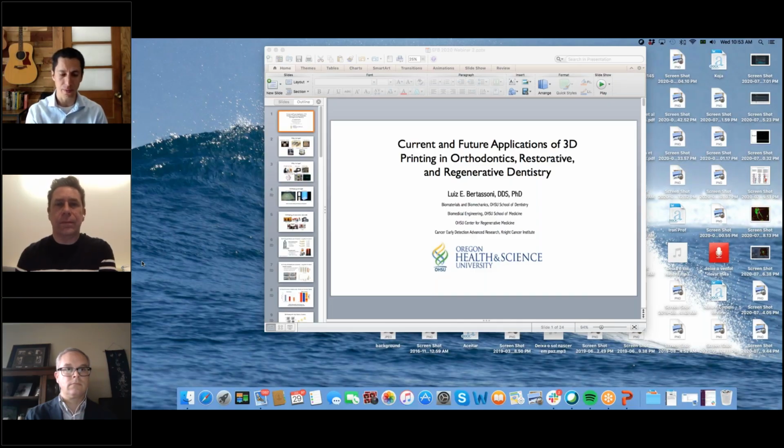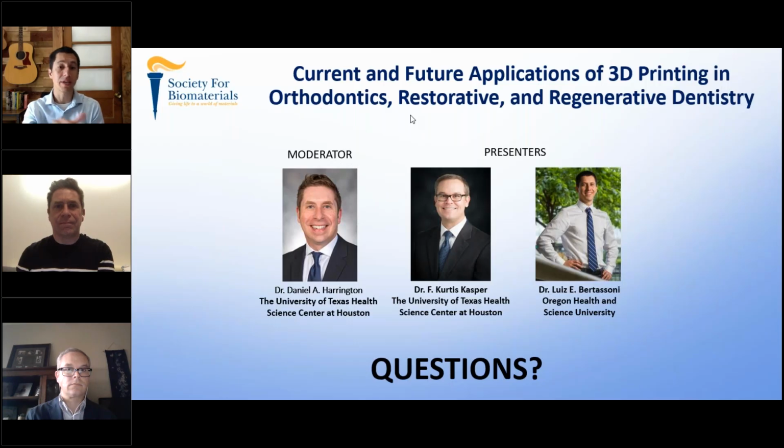I don't know if I make myself clear, but essentially, right, the fact that you're not light-curing a composite the way that we have optimized and tested and used clinically for the past several years makes that same material slightly different because of everything that we showed. Right now that we start using the same composition of material but printing at different angulations, different thicknesses, and so on, that can end up leading to residual methacrylates, which can be cytotoxic and so on.